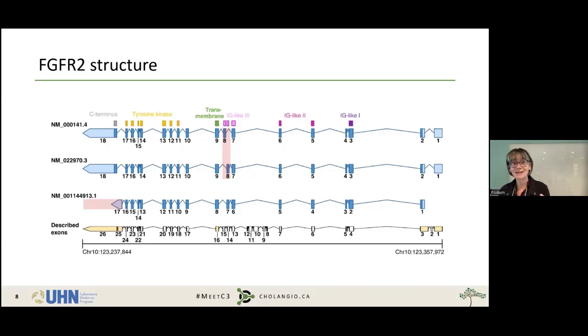But the gene gets into all kinds of trouble. It can break anywhere. It could break up front, like just downstream of exon 9. We don't really care about that. So our method has to be able to differentiate where the break has happened. Does it include the business end of this gene or not?